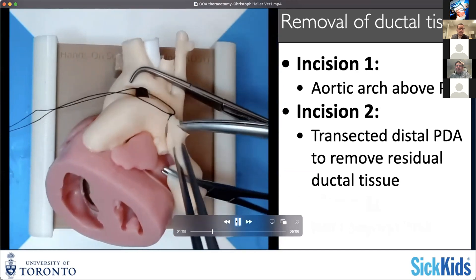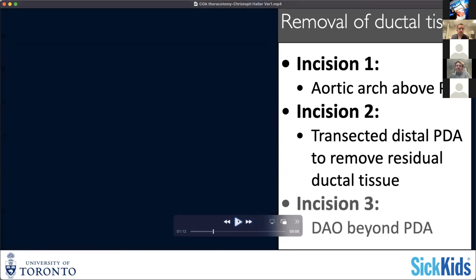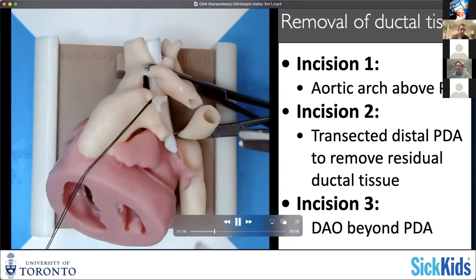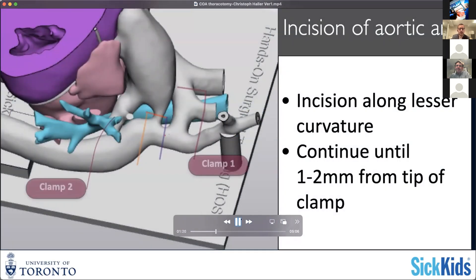You can then divide the ductal region. I usually start fairly close to the duct to make sure that I rather leave ductal tissue on either side and resect that in a second step. It is quite important — that's why I resect even where the descending aorta looked fairly okay — to show that you have to cut out everything that looks suspicious for residual ductal tissue to prevent that from contributing to re-coarctation afterwards. Having in mind, of course, that you can't resect too large a segment either, or you'll struggle bridging the gap you've created.